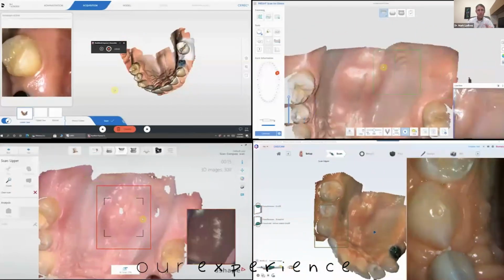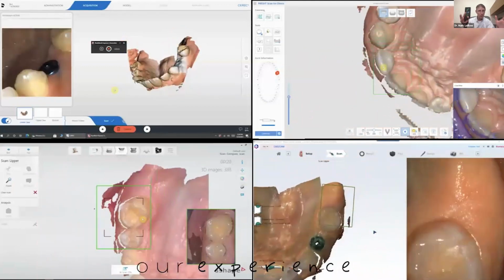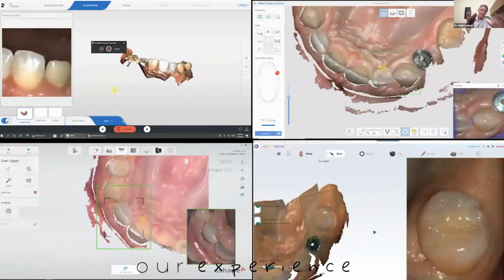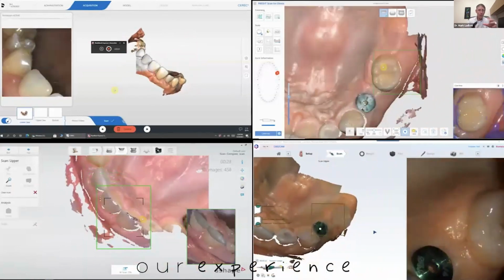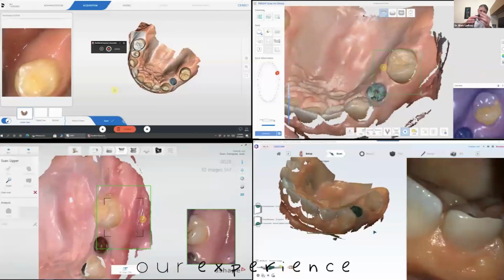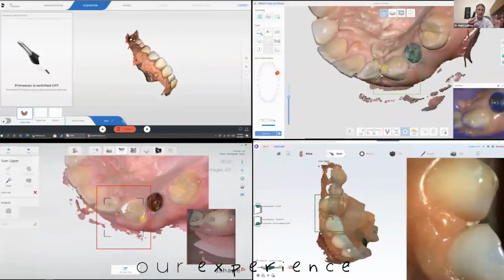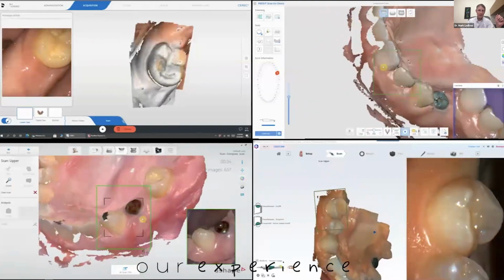Nowadays, this is 4 of kind of the most common scanners that we see on the market. Again, same patient, all in real time, everything. And you can see with it, basically, almost all these scanners have a tip about the size of my remote, okay, the head, and you put it in there, you follow a certain pattern. It's a live video camera, and you can create a digital representation of the patients.